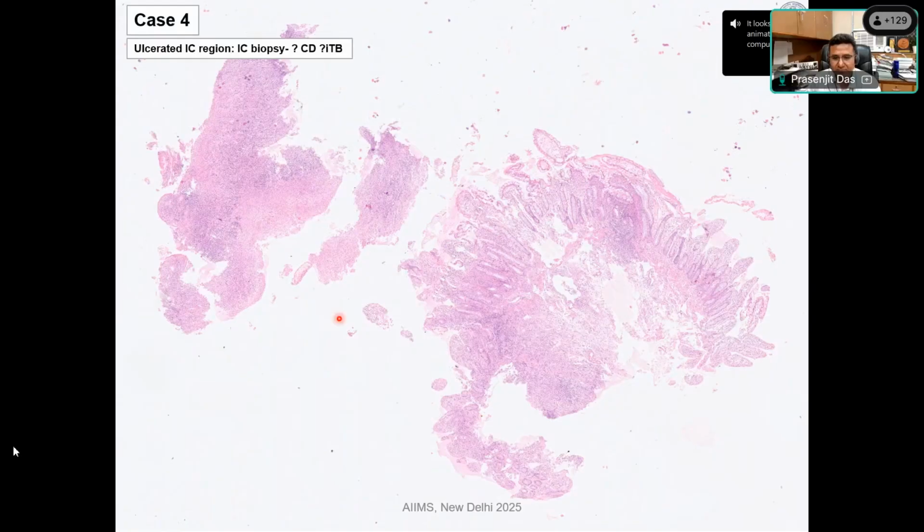Possibly. So you said inflammation is patchy. I hope everyone now can correlate. So this is an area of dense inflammation. This is an area which has very less inflammation, and also the crypts are perpendicularly situated on the muscularis mucosae. That is how we determine if the small bowel is oriented or not. The surface is actually here denuded. And do you think this is the area of necrosis? Yes, sir. Okay. Definitely we can say there are some geographical pale areas, that we'll see in high power.